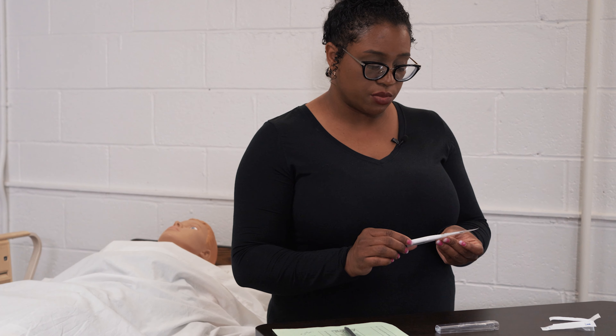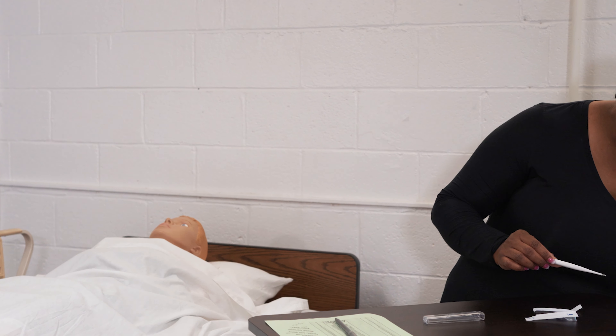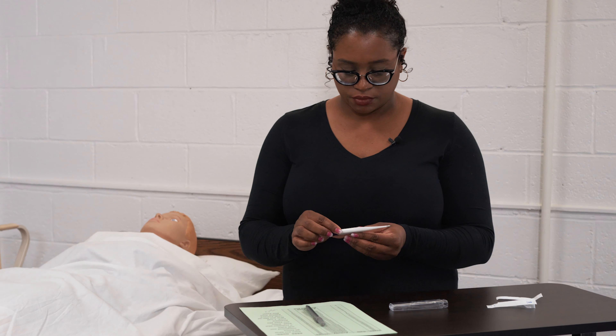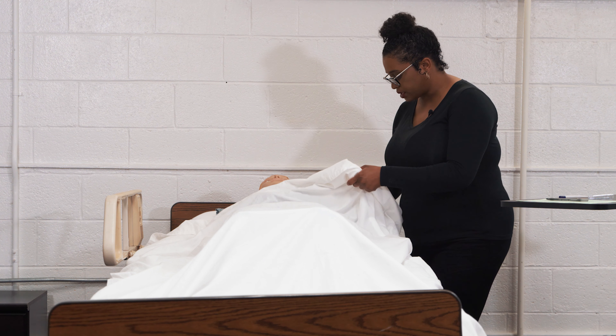We're going to remove the thermometer probe and throw it into the trash. We are then going to replace the resident's gown.